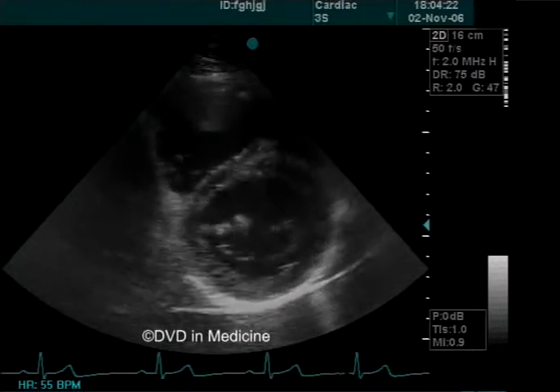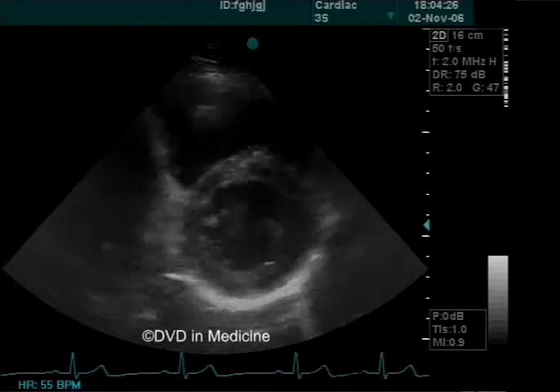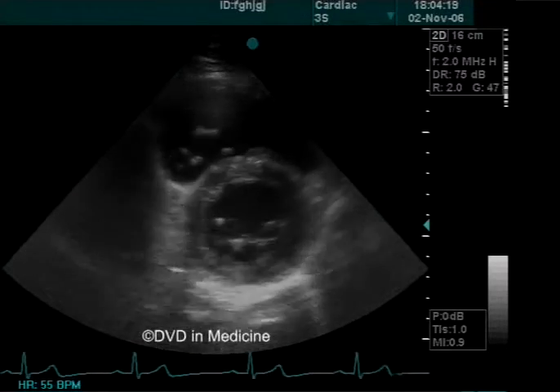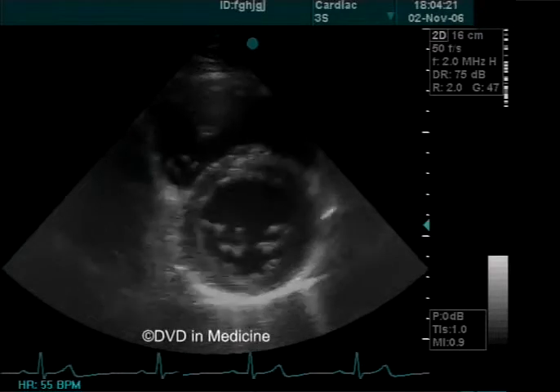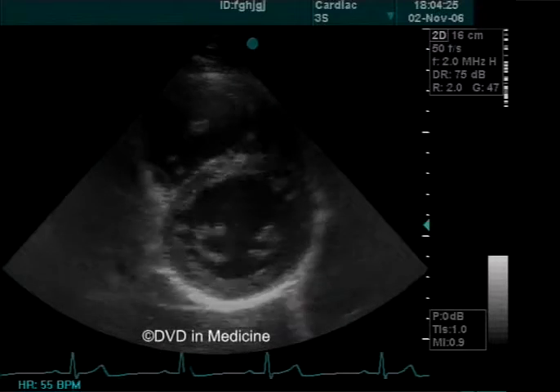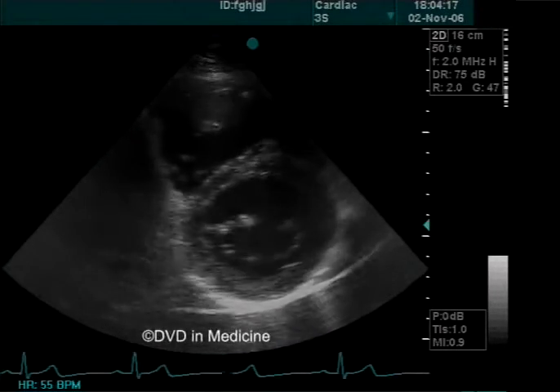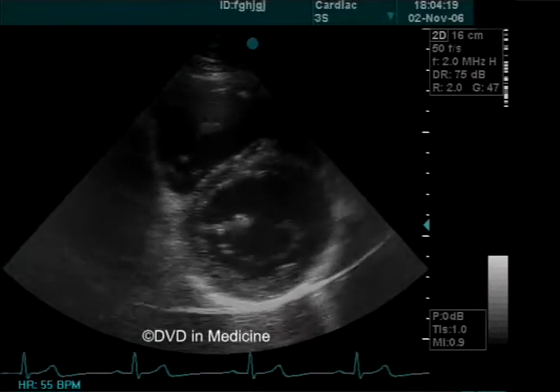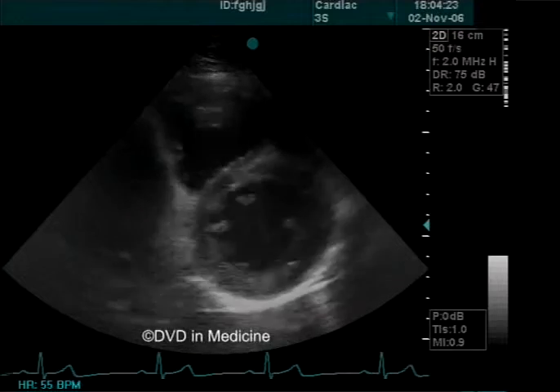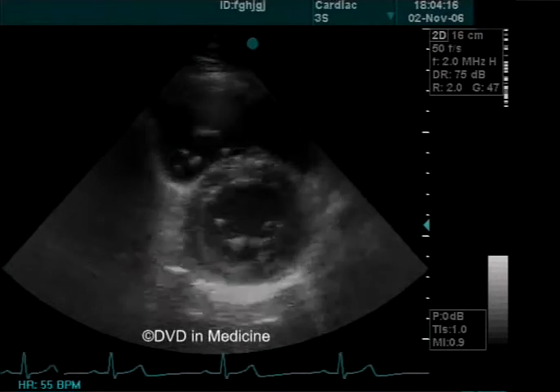3. One can also assess the motion of interventricular septum. As a norm, it should occur during the left ventricular systole. Thus, the interventricular septum moves towards the center of the left ventricle. 4. One can assess the shape of the right ventricle. It should have a triangular or crescent-like form, and the right ventricular free wall in systole should move in the same direction as the interventricular septum.